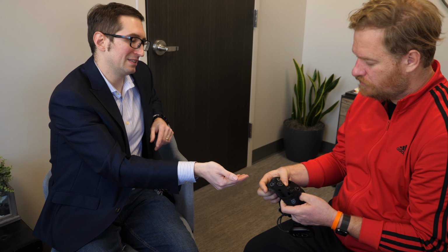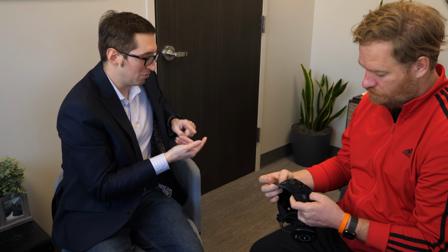What's great about this thing is that you've got really, really good temporal resolution. So we can see changes very quickly, and you can stand up with it. You can sit with it. Other things is, when you're in a scanner, there's loud noises around you, so it's hard to get into the auditory system. This we can put on someone, have them do a task, have them sit up.